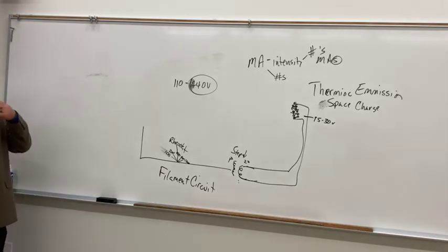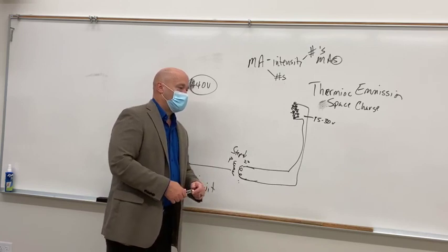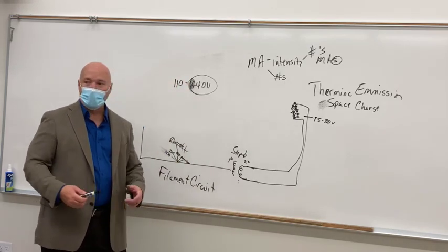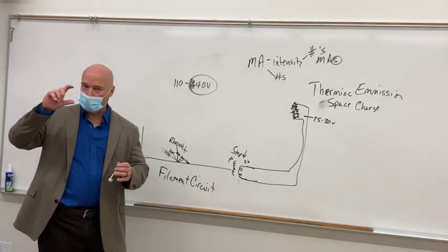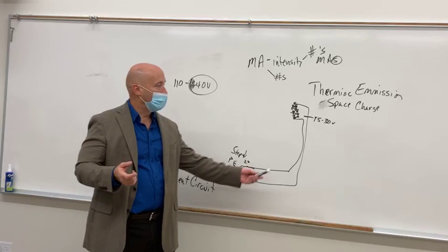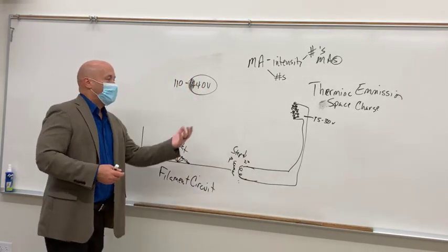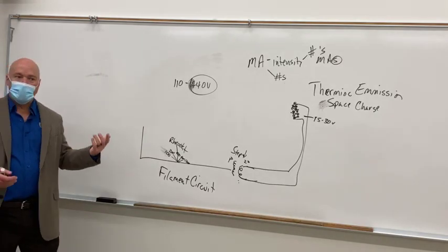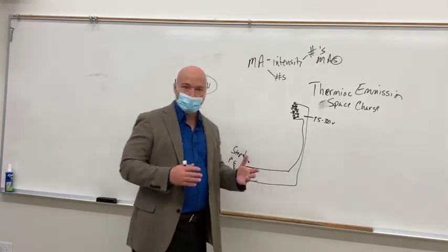So for context, the electricity in the wall is 110, 120 volts. Those little bitty square batteries, that's 9 volts. So twice that, so very, very low voltage. The electricity is not going to jump off of 15 volts to travel from cathode to anode, okay?